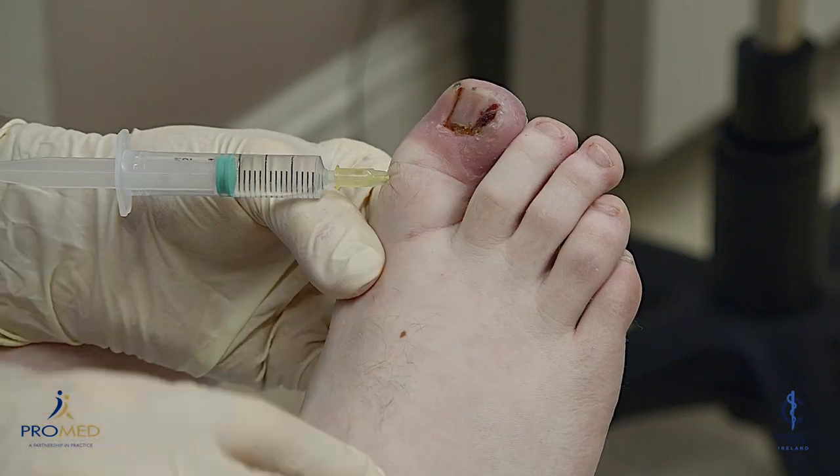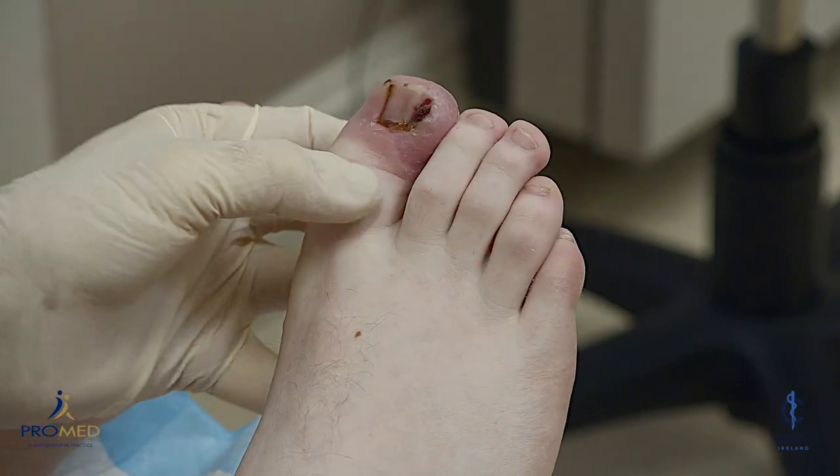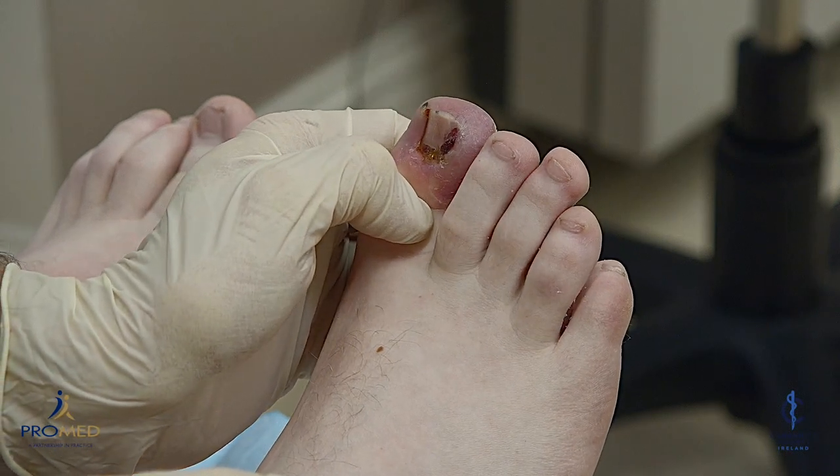So when I go in this side, it's going to be a little bit less sore. It's still going to be stingy because it hasn't had enough time, but applying a bit more pressure with my finger helps. Another pinch now, Scott.